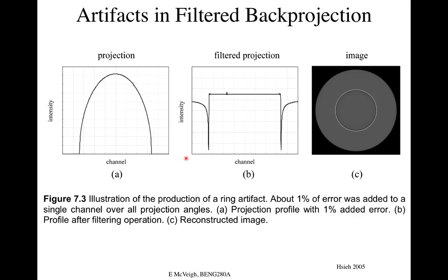In the case of the bucket of water, what would you use for the casing for the fan to minimize the actual detection of that object? So the question is, in this bucket of water, how do you get the estimate of what the gain is on this detector individually?